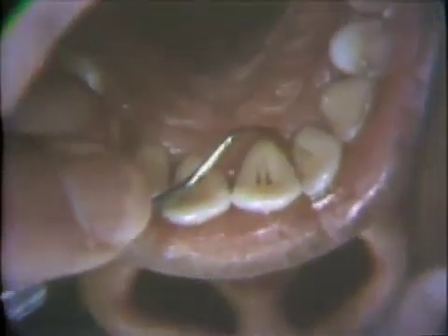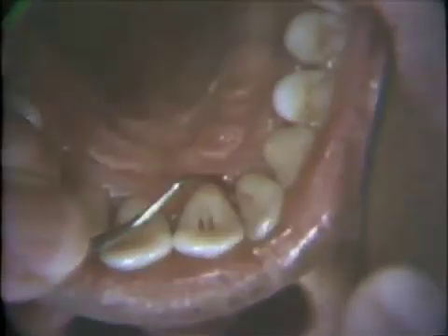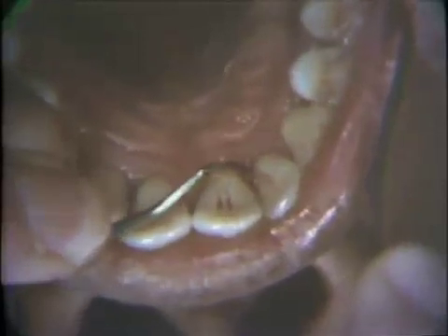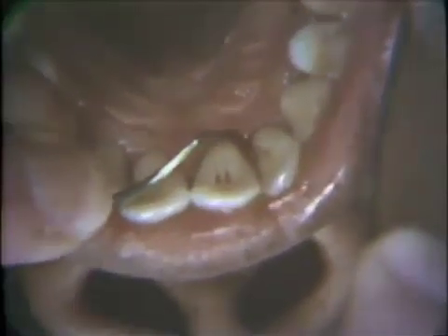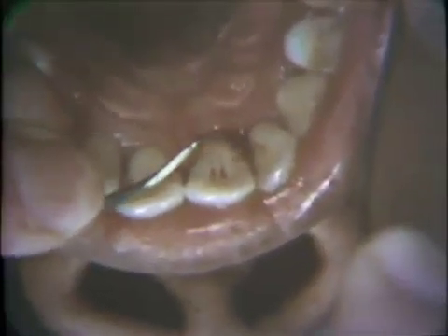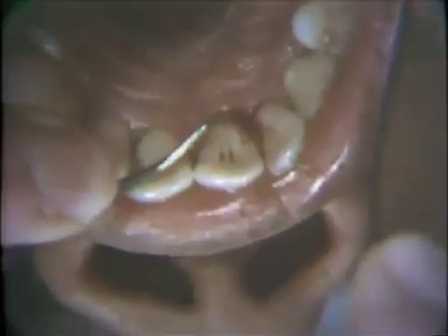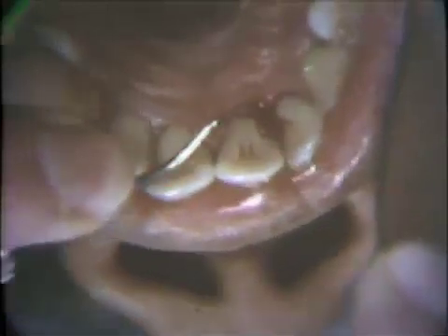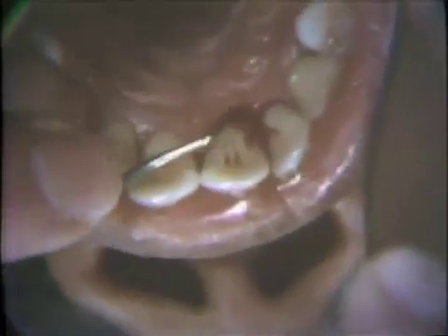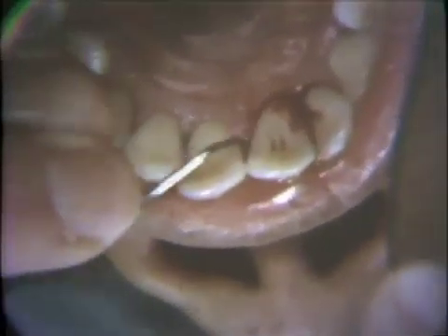On the palatal side, either a jacket type of sickle scaler or a small curette may be used. Special attention must be paid to the cementoenamel junction and the interproximal surfaces from the palatal aspect.